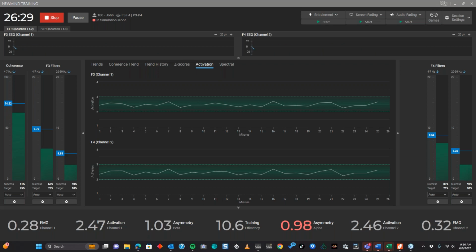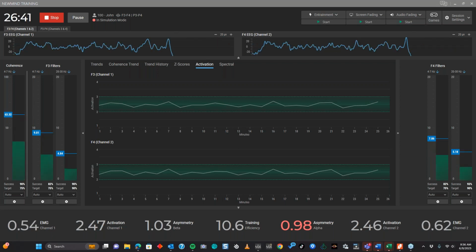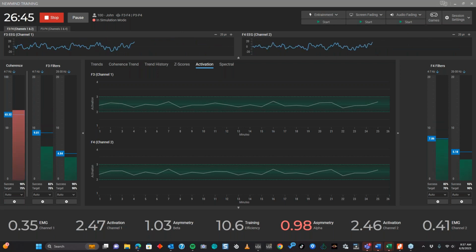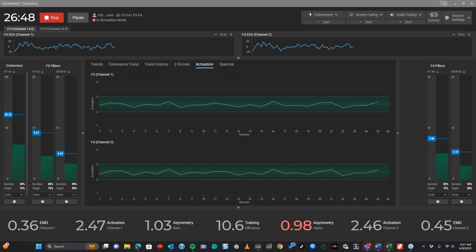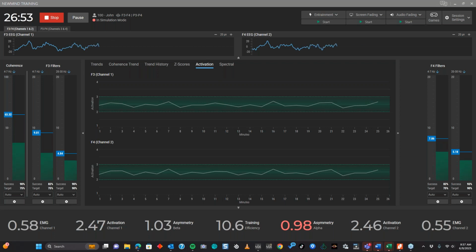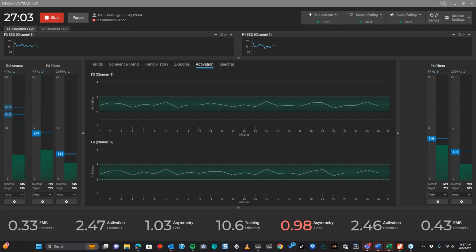I've also, on the EMG ones, I was doing a map training with a new clinic. The doctor had her young son there as the guinea pig. And as we were going through testing locations, we got to T3, T4, and it was just straight artifact. You could see it was definitely muscle tension in the waveform. And I kept asking the kid, drop your jaw, relax.